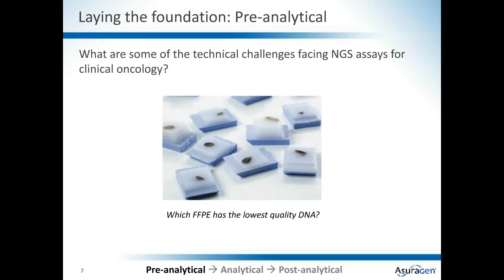When we compare the QFI assay score to the relative DNA concentration measured using, like, a Qubit assay, you can see there's a general relationship between these two assays for the higher quality DNA samples, but this relationship falls apart for the lowest quality samples. So once you drop below about 3% in the QFI assay score, Qubit is no longer informative, even though the QFI assay itself has a very broad dynamic range; you can quantify well below this point. The challenge here is that it's these low quality samples that typically are most at risk to generate false negatives and false positives.